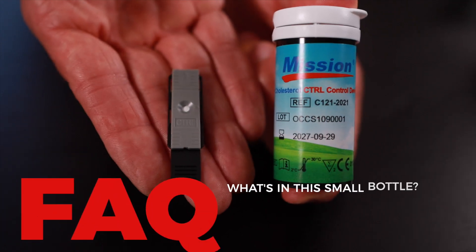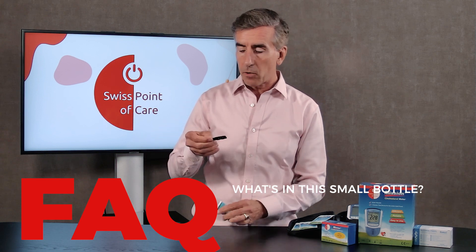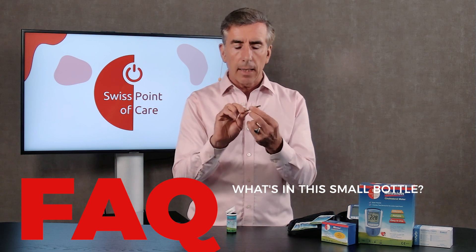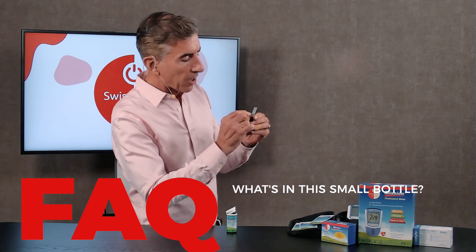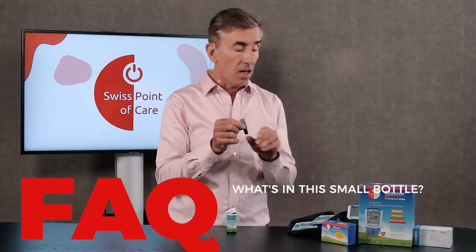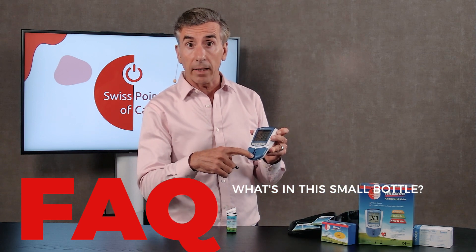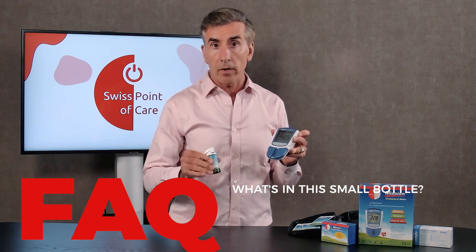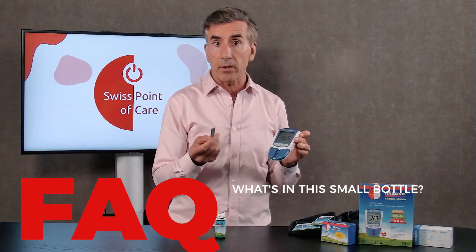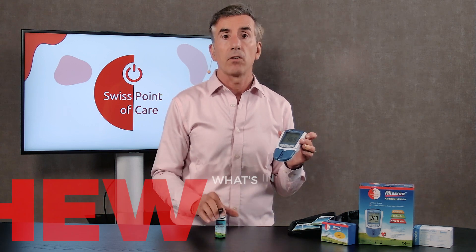What's in the small bottle? In this small bottle you will find two what look like test strips — they are light gray, and if you look carefully you will see CTRL, meaning control. These only test whether the lights are blinking; it's a mandatory thing for medical devices. You cannot test blood with them — you cannot put blood on them. So I would recommend that you just discard them.